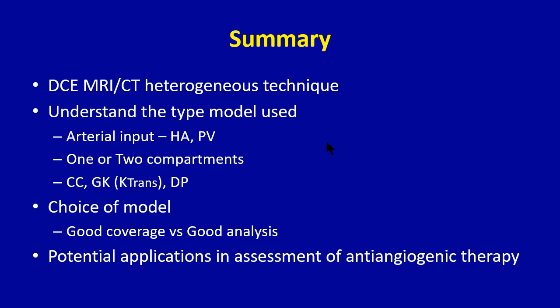But the tumor concentration curve is so useful to the radiologist, it's hard to believe that quantitative parameters are actually not useful. So hence, there's actually opportunity for us to do a lot of work here.